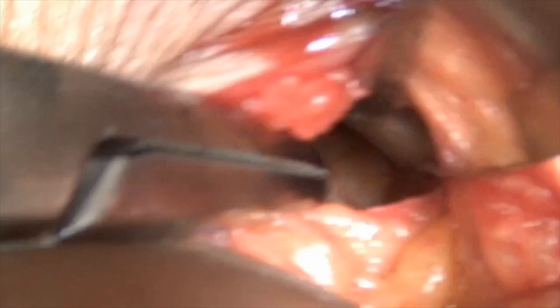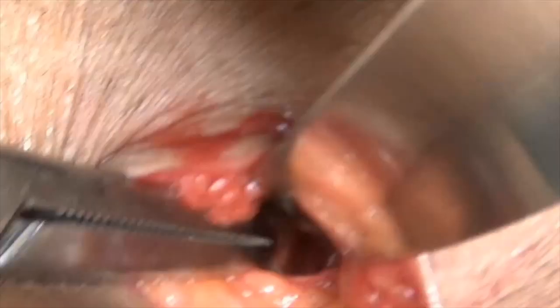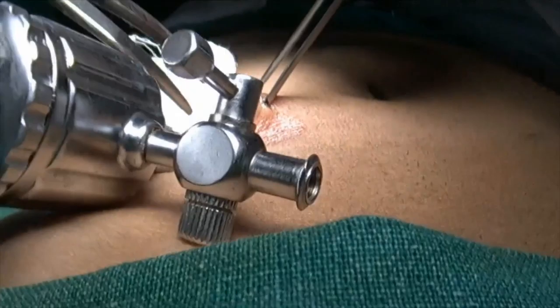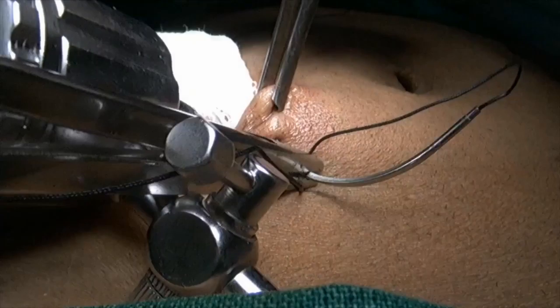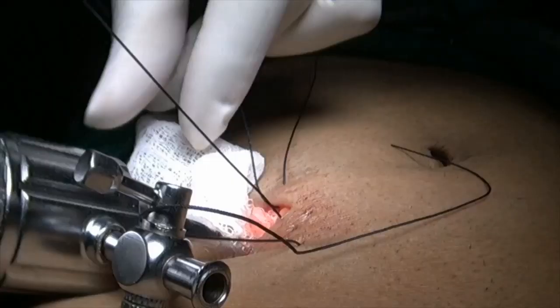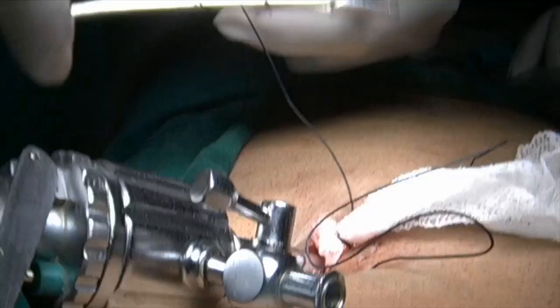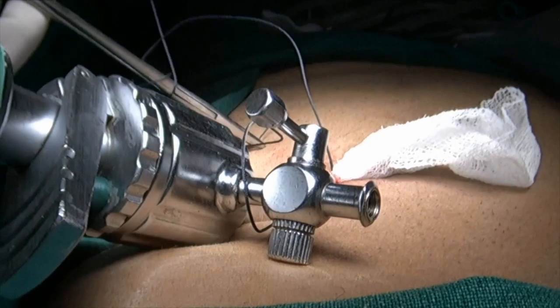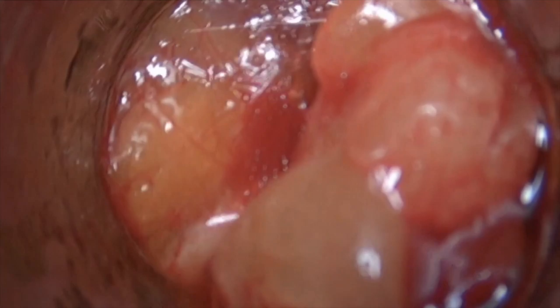So now we are just using the artery to open the space, and now we are retracting the muscle, and you can see the retrorectus space, that's the posterior rectus sheath, and this is the rectus muscle which was just retracted. And then we use the trocar without the obturator into the space bluntly. We just place a saline soaked gauze in that area and we just put a suture, and we take the suture in between the port and the gauze in such a manner when we tie it, it would be airtight and reduce any possible leakage of air happening from this area. The other advantage of putting this port is to secure it to the gas channel as well, so that the port doesn't come out accidentally. So this is done in all our TEPs and e-TEPs.